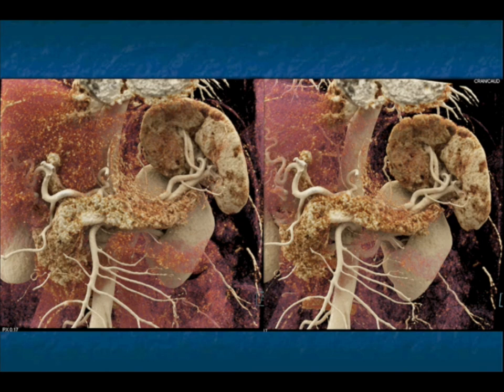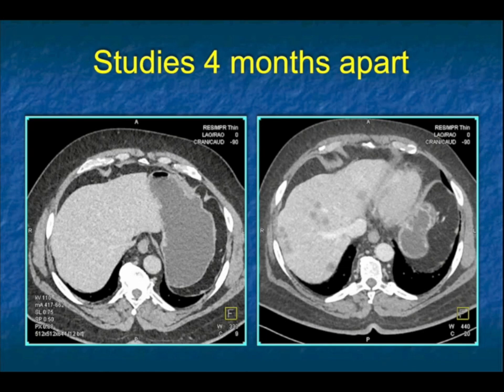Can we pick up ever smaller tumors? Can we classify tumors better? That's something we're working on, and I think the answer is going to be very positively yes. But that will take a little bit of time for us to figure out, of course, and we're doing lots of work in that regard.